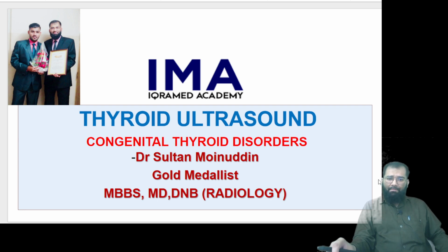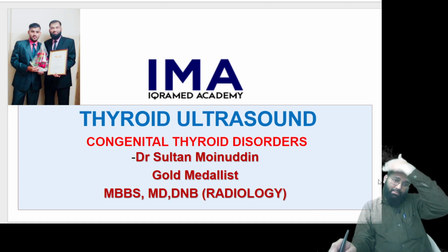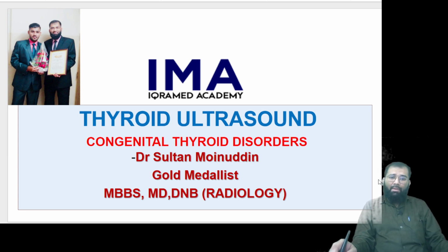Before this, we have seen various other ultrasounds, modalities, techniques, the methods of diagnosis, the image findings. In today's session, we are going to discuss a few congenital thyroid anomalies, a few congenital thyroid disorders, and the image findings, that is basically the ultrasound findings in these patients. Thyroid is one such gland which can be associated with multiple anomalies. Now let us start with the topic.